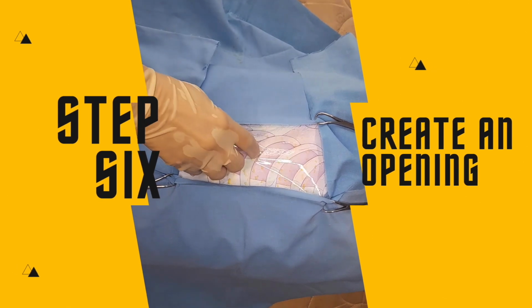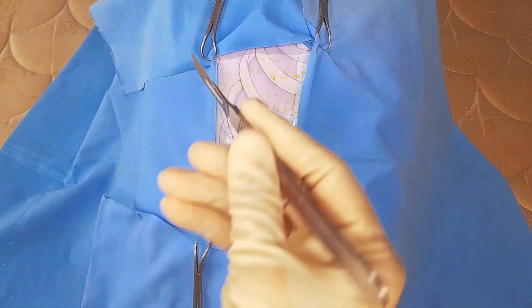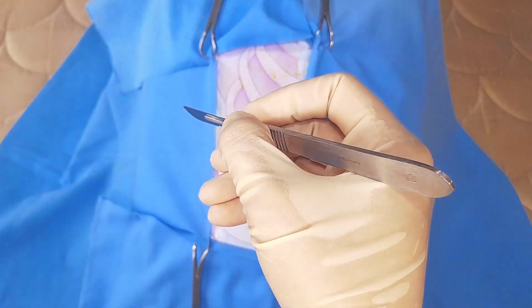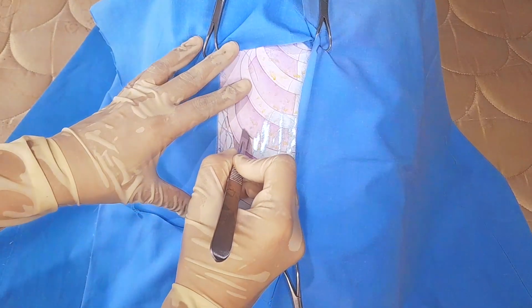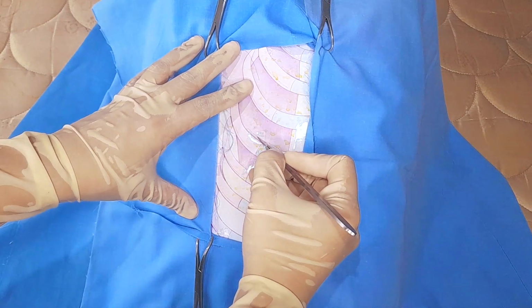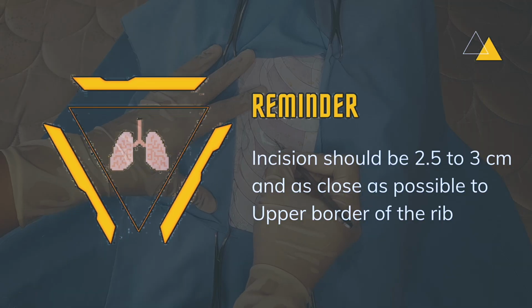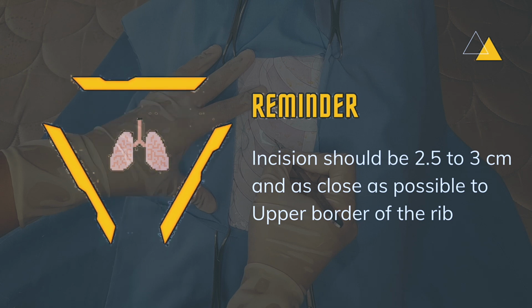Step 6. Create an opening. Hold the scalpel in a pencil grip. Incise in a straight line at the 4th or 5th intercostal space, still at the anterior axillary line. Reminder: incision should be 2.5 to 3 centimeters and as close as possible to the upper border of the rib to avoid hitting neurovascular structures at the lower border.